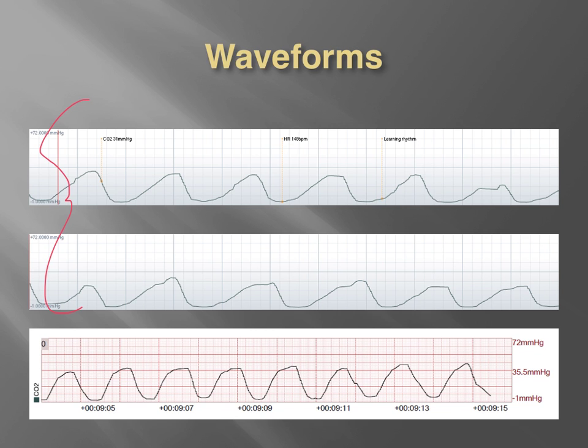However, we were right on the cusp of getting that in line with our protocols, and we had two choices with this patient because he pretty much ripped off his nebulizer mask and said, "I can't breathe, I can't breathe." And what ended up happening is, we can't see it in these strips too well, but his waveform was worsening, just like it is now, except his end tidal was shooting up towards the 60s and 70s and maybe even higher than that.